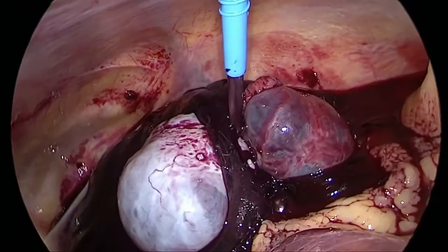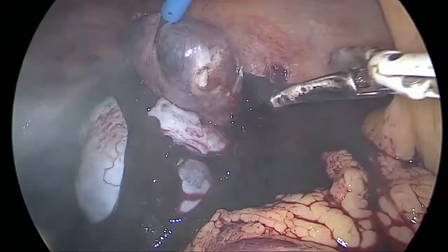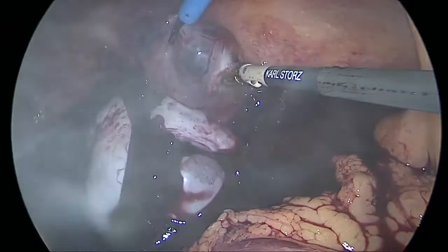The moment we started clearing all the blood clots, we found some active bleeding from the ectopic sac. Using bipolar energy, we were able to stop the active bleeding.